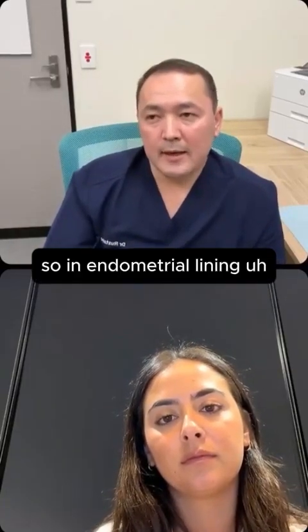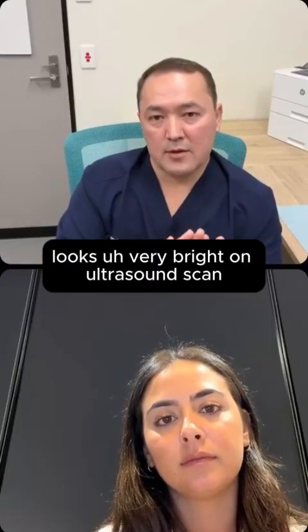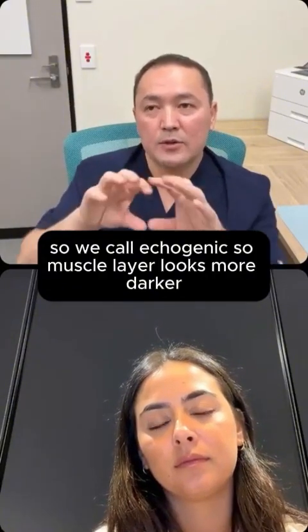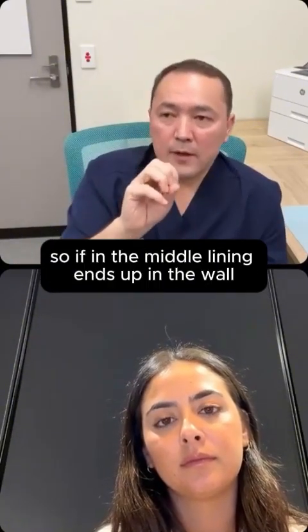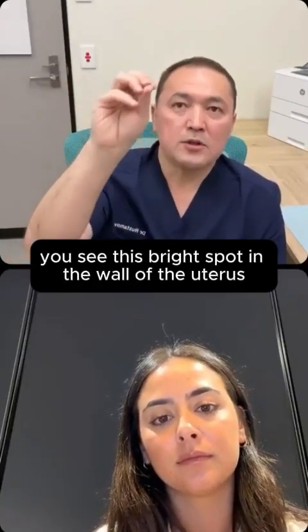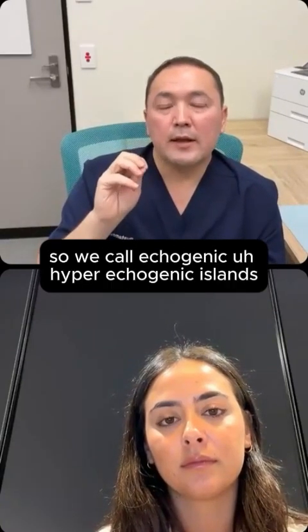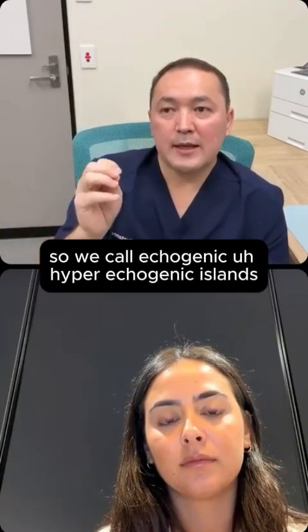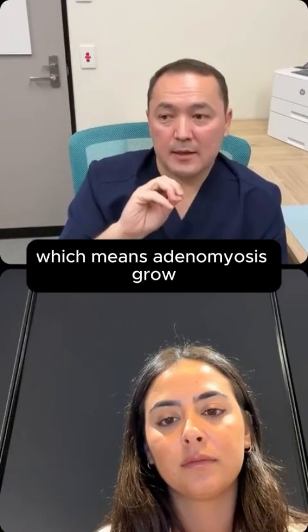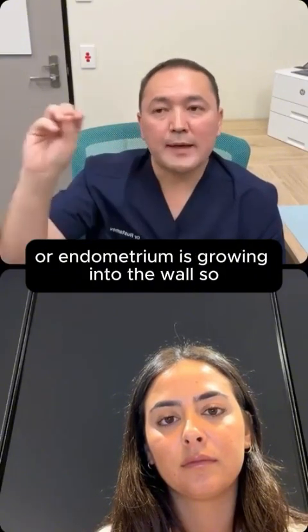So endometrial lining looks very bright on ultrasound scan. We call it echogenic. The muscle layer looks darker. So if endometrial lining ends up in the wall, you see these bright spots in the wall of the uterus, which should not be there. We call them echogenic, hyperechogenic islands. That's a sign of adenomyosis, which means endometrium is growing into the wall.